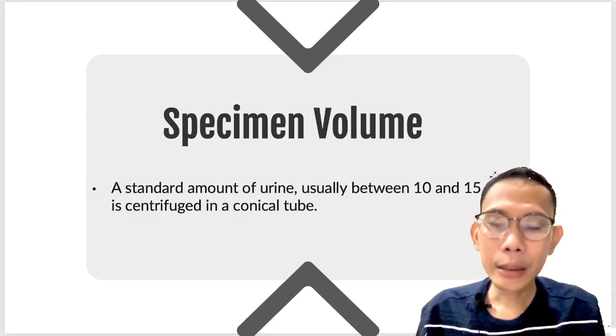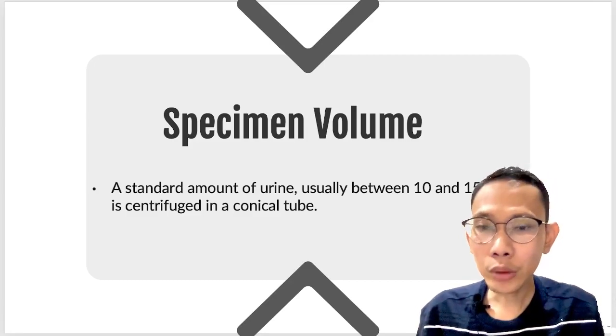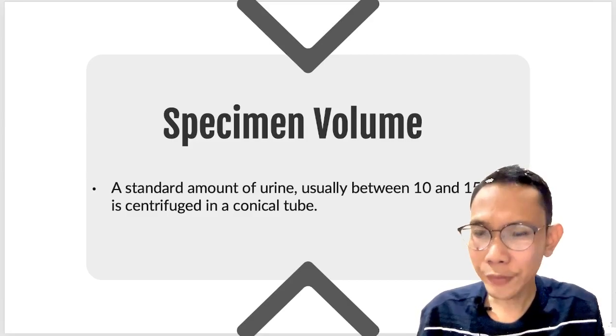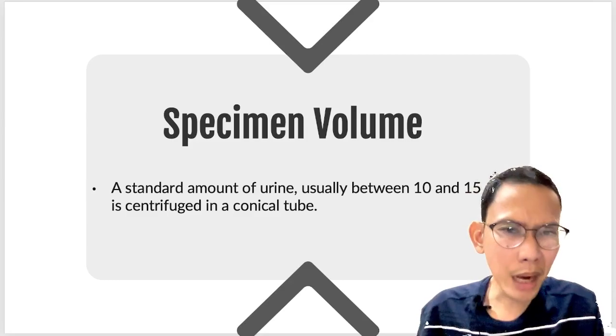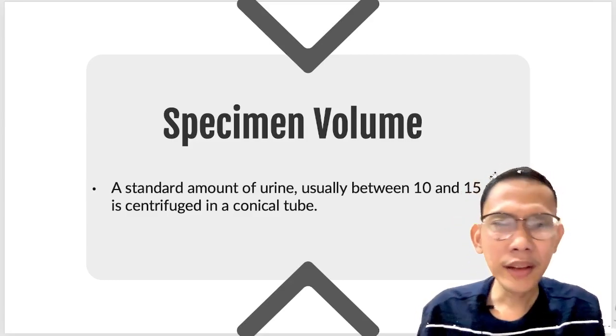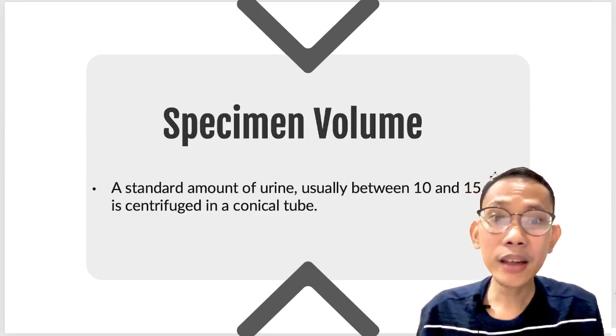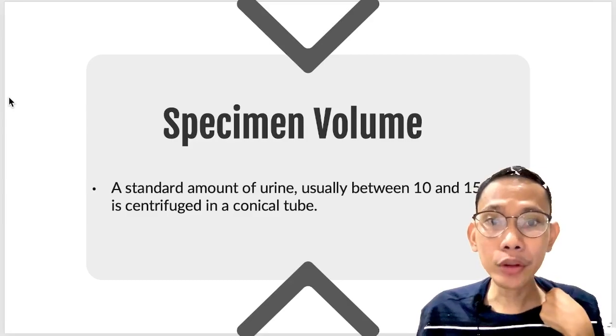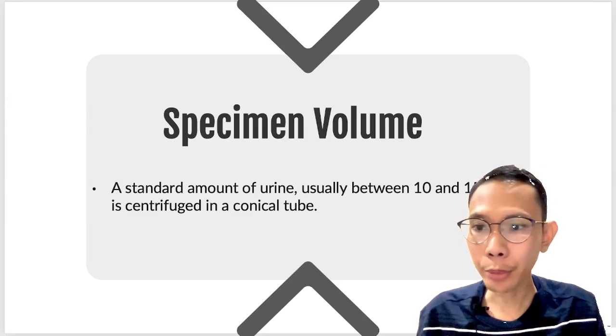I always do repeat collection, but that will still depend on your patient. Kung pediatric patient, you still have to check it. Pag check mo, somehow there is a correlation with the diagnosis of the patient, then might as well release the result. Okay? But again, that will still depend on the hospital protocol or laboratory protocol.